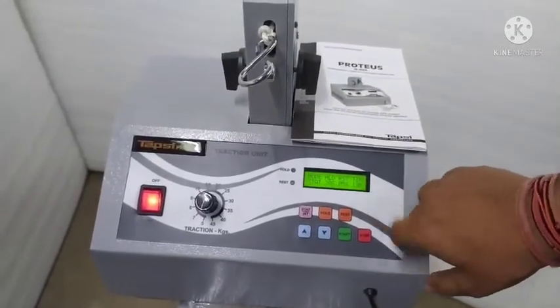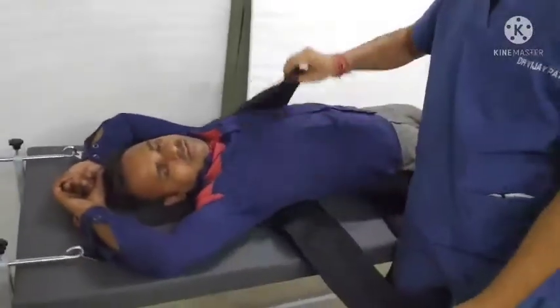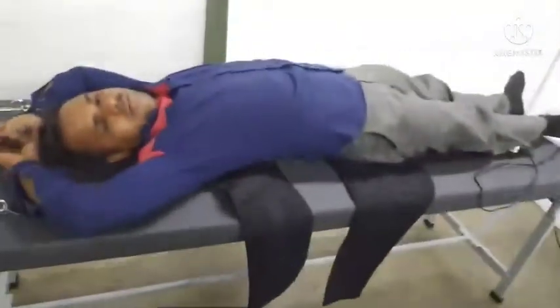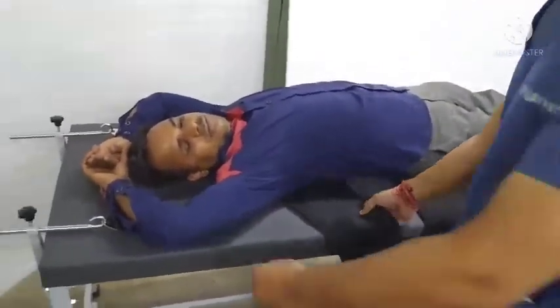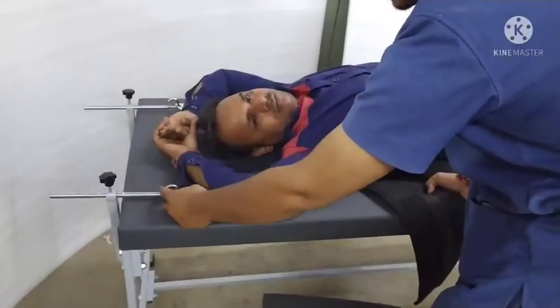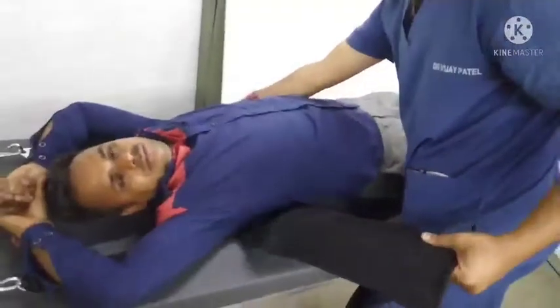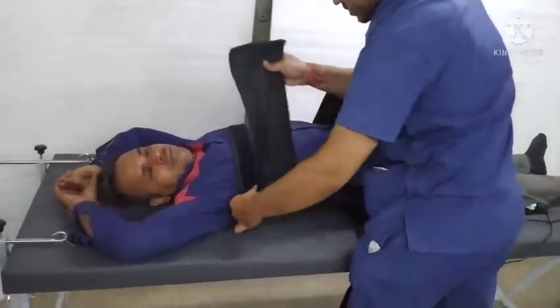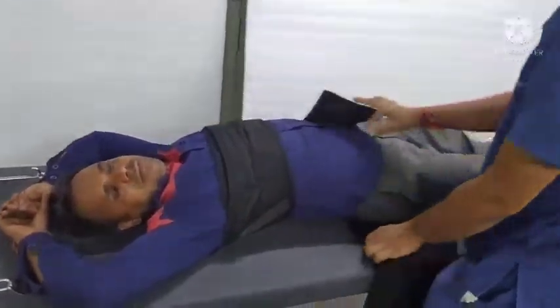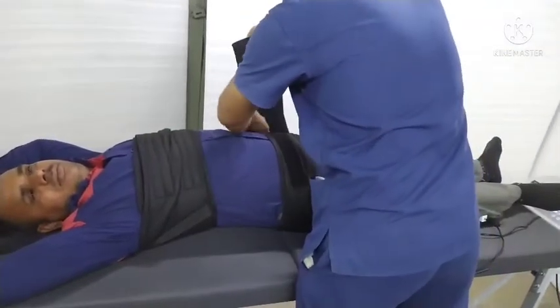We select 10 minutes, and okay, now we apply the lumbar traction to the patient. This is a chest belt which is fixed with this bar, and this is a lumbar belt. First of all, we apply the chest belt. Then the lumbar belt.